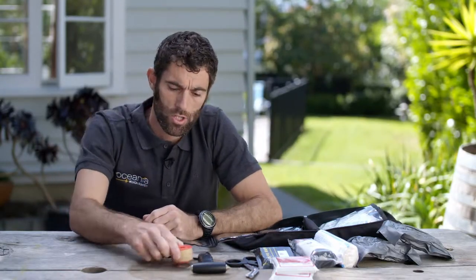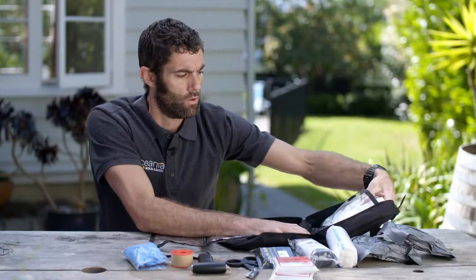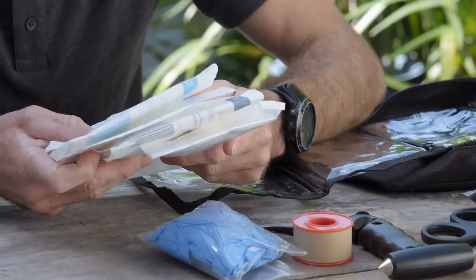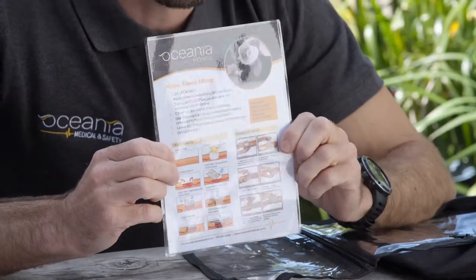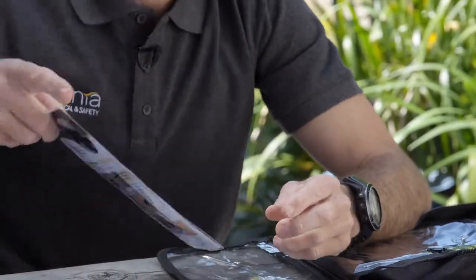We've got tape to secure any dressings, gloves for self-protection, and four combine dressings of different sizes — these can hold pressure onto a wound in combination with the Celox Rapid gauze. There's also a bleeding control card that goes over the Celox Rapid bandages and tourniquets.